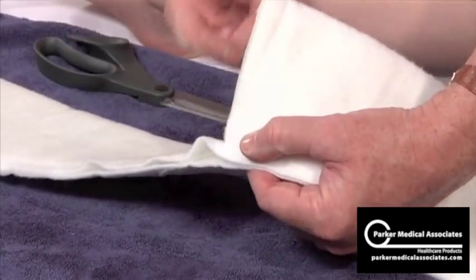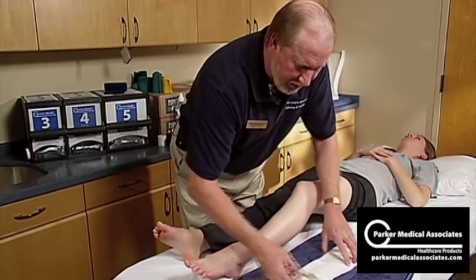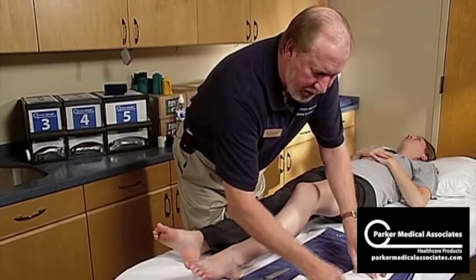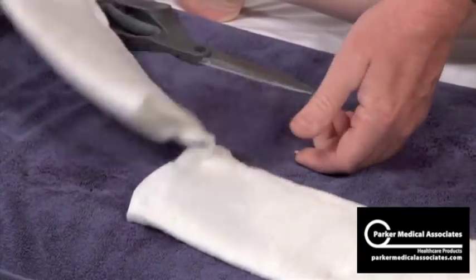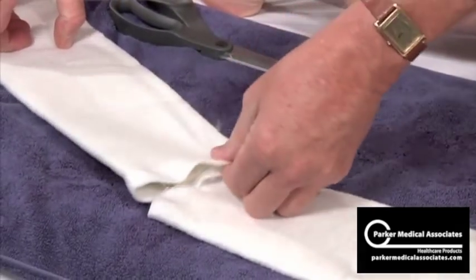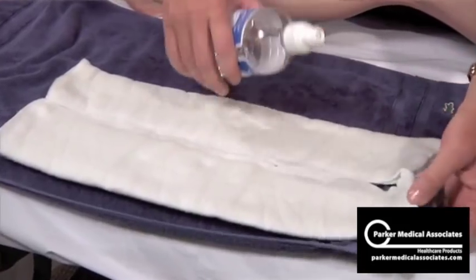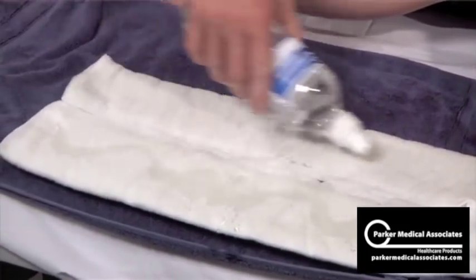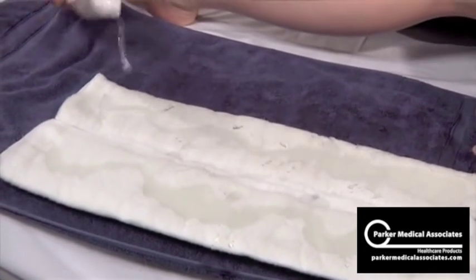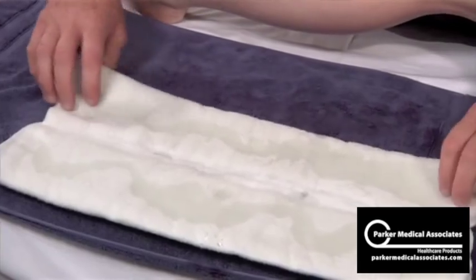Because I created fiberglass edges here, stretch the padding — stretch, turn, stretch. And again, stretch on this side, turn, and stretch. Because it is 4-inch, I tend to zigzag at the width of the splint — it just covers more of the splint. One side, then the other side.